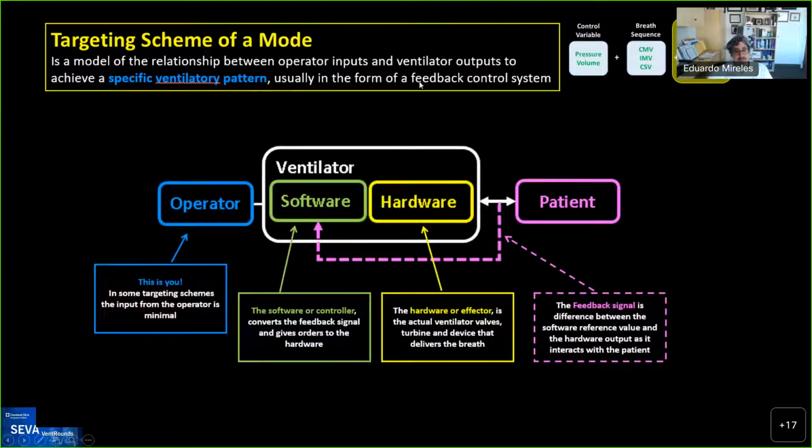Rob? Yeah, that's pretty complicated. I'm going to post a paper that talks about closed loop control in general, if people want to look deeper into it.